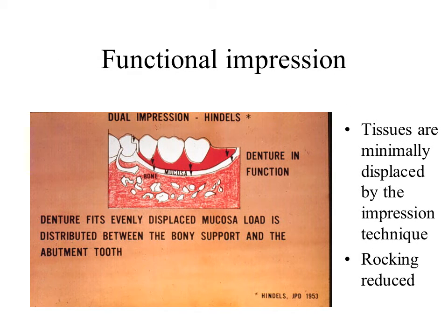Correct application of this technique will prevent rocking in the mouth after the definitive base is placed during processing of the partial denture. Accomplishment of this procedure also allows one to refine the borders of the denture, if necessary.